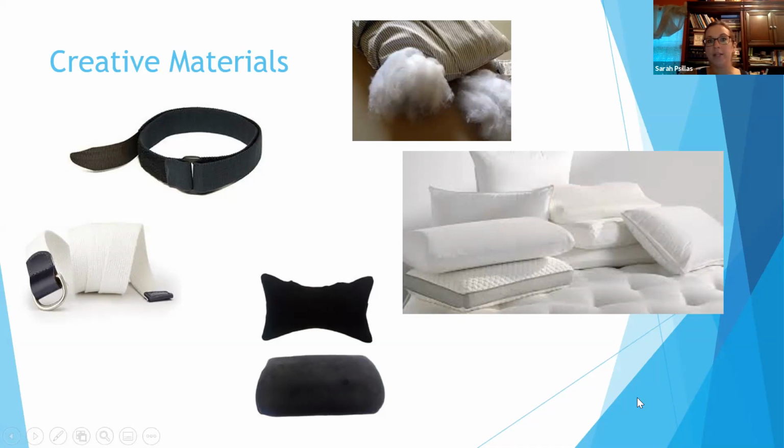Another great resource are pillows, and the image at the top is really pillow stuffing. A lot of times I have interacted with people who have done some Therapy Without Borders trips, and I said, what is the one piece of advice you would give someone? And she said, pillow stuffing. She said they used it constantly. So you can take a pillowcase or an already made pillow and put more stuffing or less stuffing to help position someone. So that is a good trick.